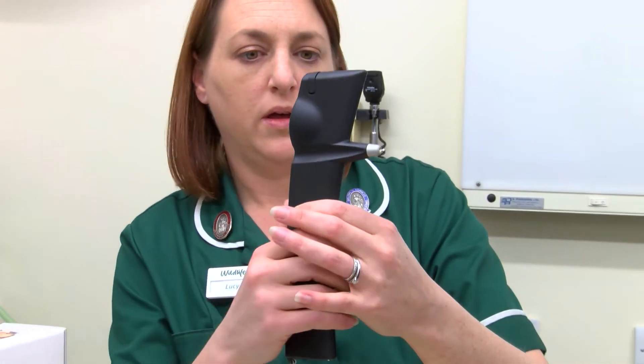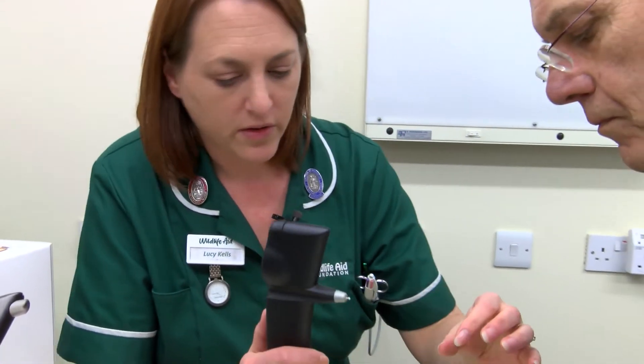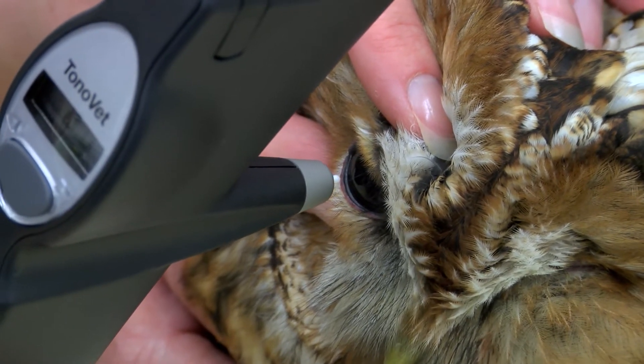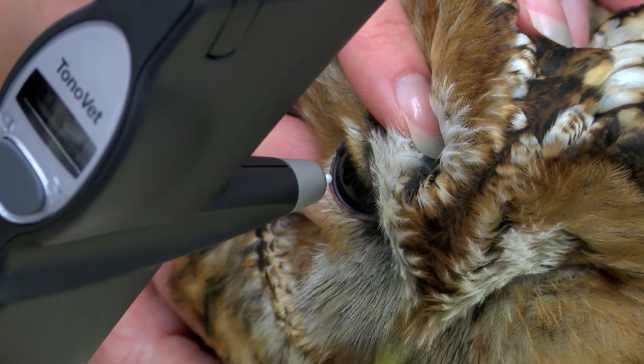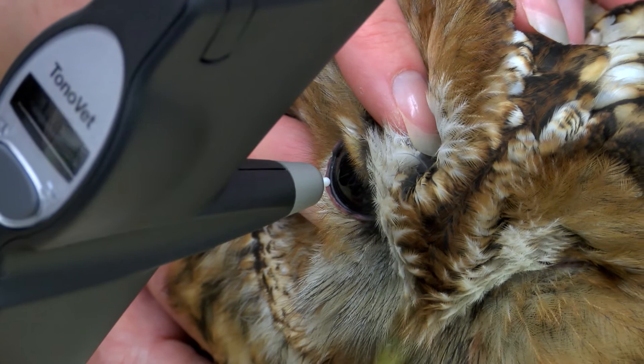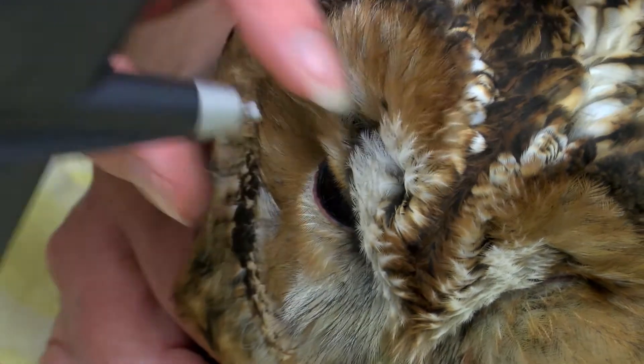I'm going to do the good eye first. Got your feet out the way. Twelve.